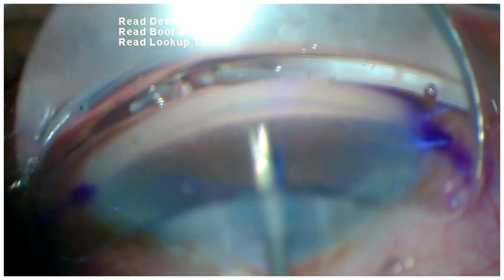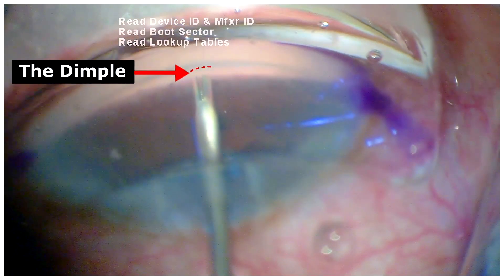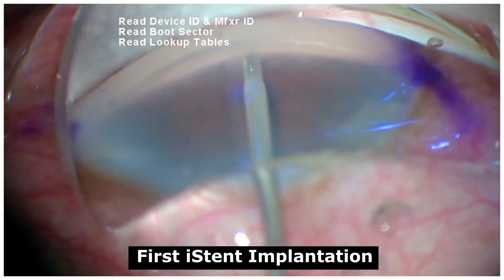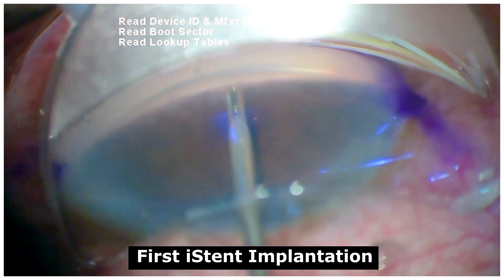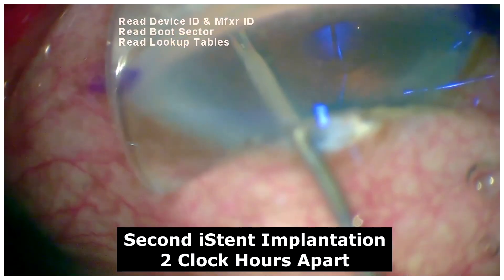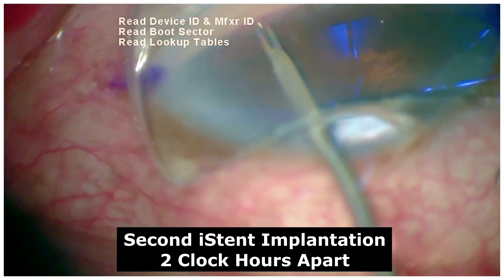For proper placement of the G2 iStent, we need a proper dimple at the angle depicting good firmness to ensure that the iStent is well placed within the trabecular meshwork. Additionally, a second iStent is placed in the similar manner at least one to two clock hours apart.